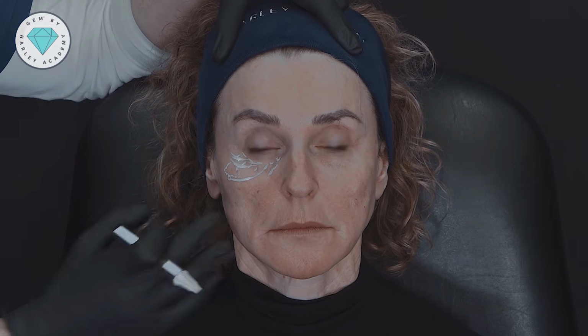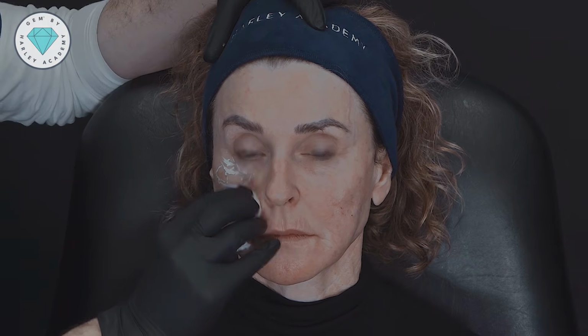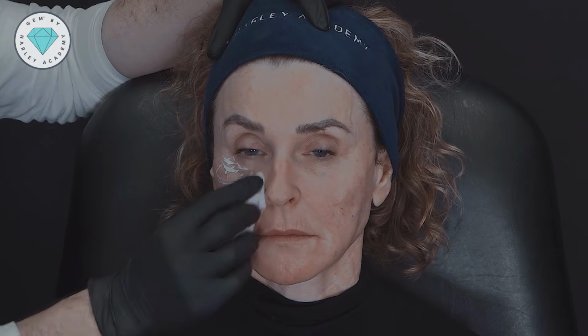But remember that we generally want to be working from deep to superficial. And so there are deeper targets in the midface that I want to treat before the tear trough. And the first target is going to be the deep medial cheek fat. This is what I suspect was the intended target for the original filler treatment, because we're trying to restore some of this deep volume in the midface.